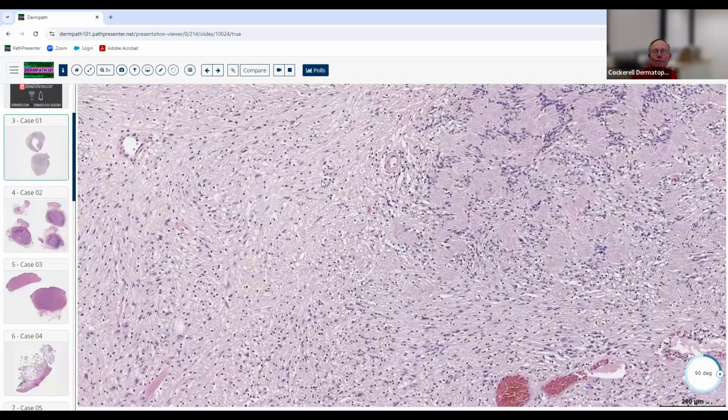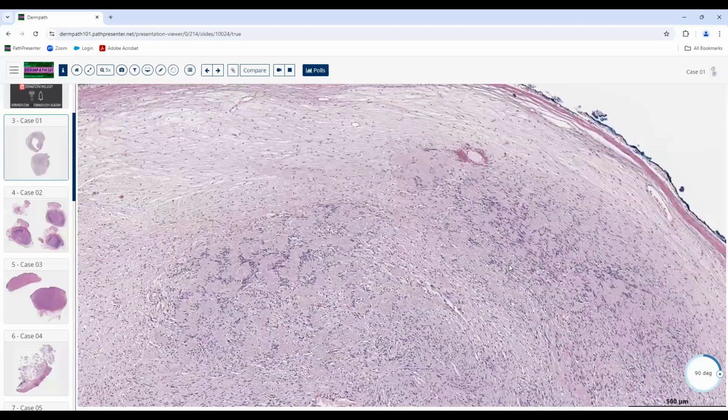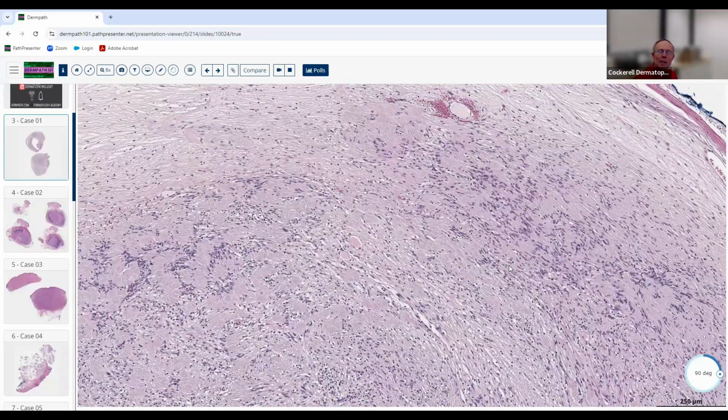What do they tend to look like? Maybe more foamy. They can be foamy. Sometimes they can be. Yes, they can. But usually they're a little bit more sharply angulated. And you get histiocytes that almost look like they have little sort of spikes at the periphery sometimes. If you see a fibrohistiocytic cell in a dermatofibroma or an atypical fibroxanthoma, they look more like sharp angles as opposed to being cigars or blunt-ended nuclei or cells with these delicate S-shaped nuclei. So each one of them looks slightly different. So go back and look at those when you look at it under the microscope.